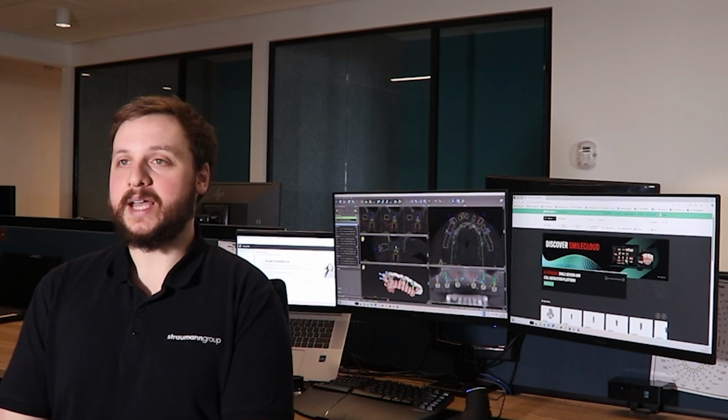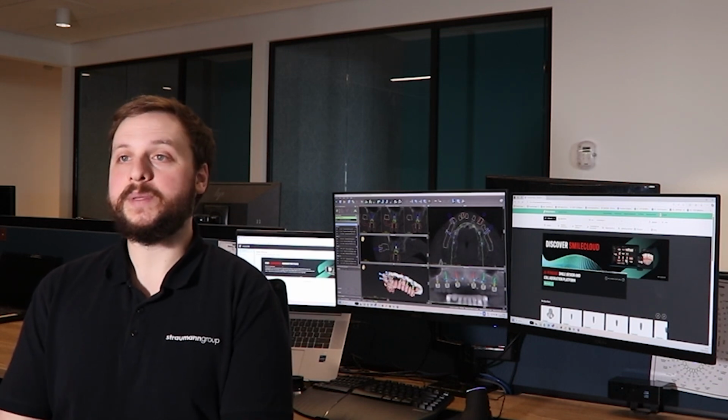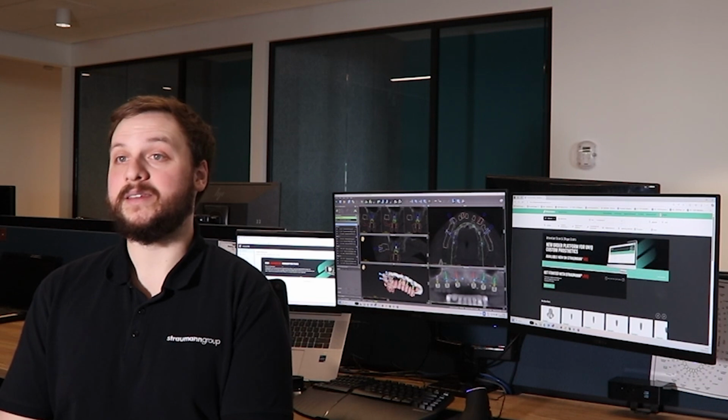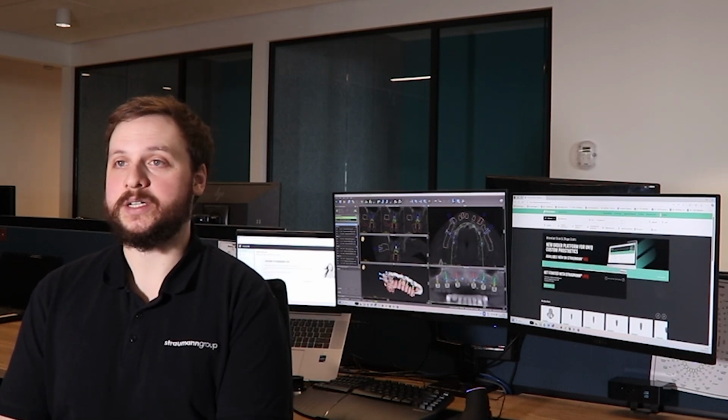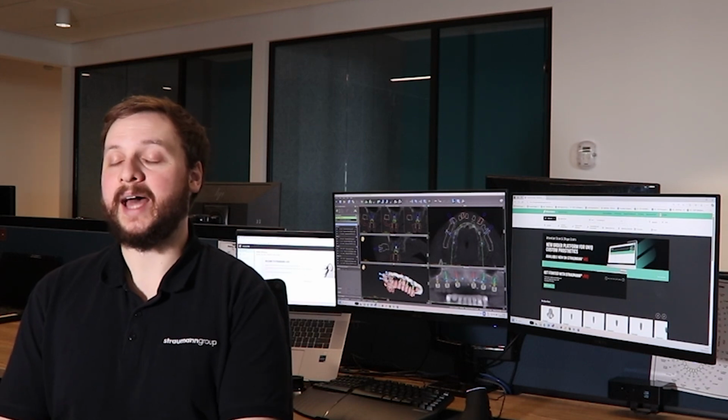We also receive CT scans and intraoral scans that cannot be aligned together because they were acquired at different times. It is very important to provide us with recent scan acquisitions and to proceed with the acquisition at the same time.